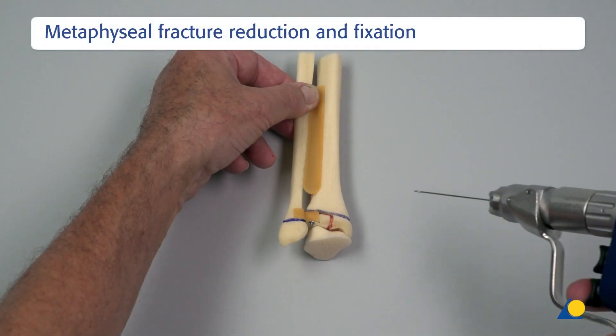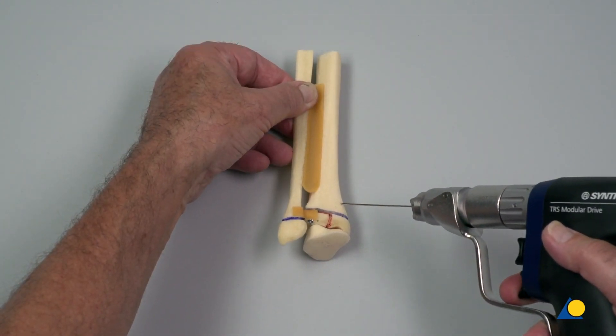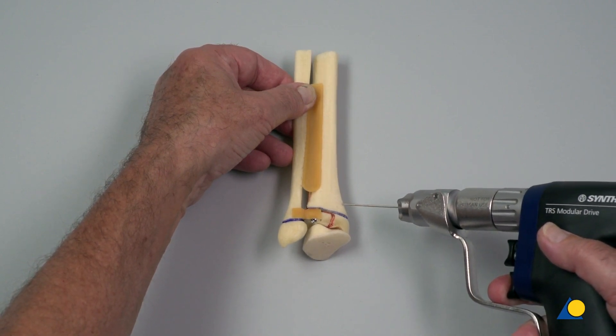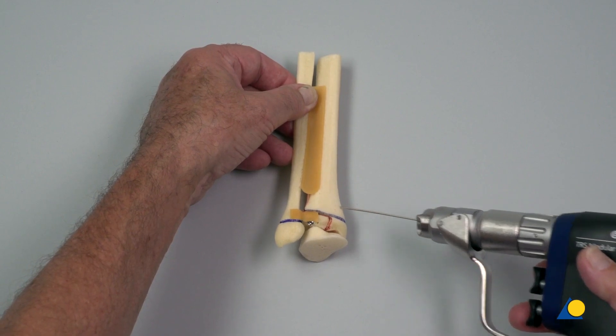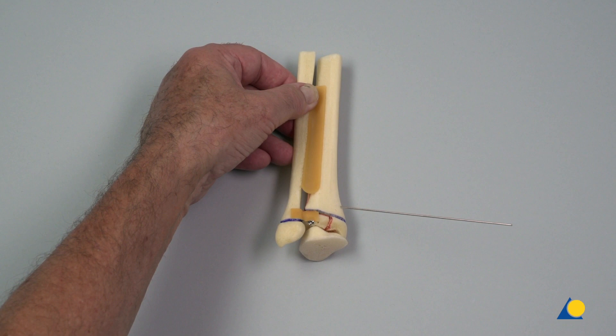Depending on the size of the lateral dorsal Volkman wedge, a second screw from anteromedial may be recommended. Normally, if the wedge is smaller than 2 cm, the distal screw is sufficient for joint fixation. Here, a second cannulated screw will be inserted from anteromedial to posterolateral.